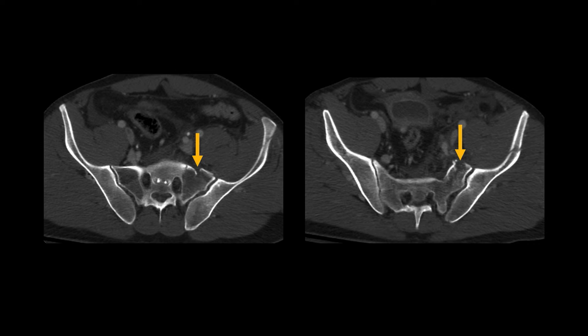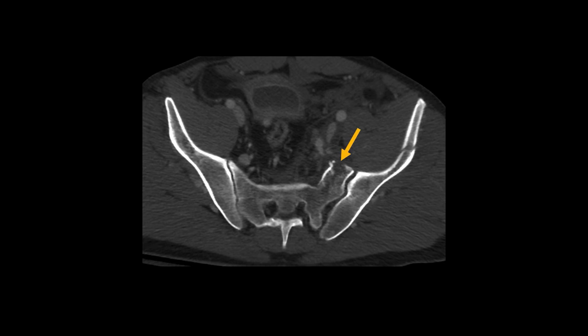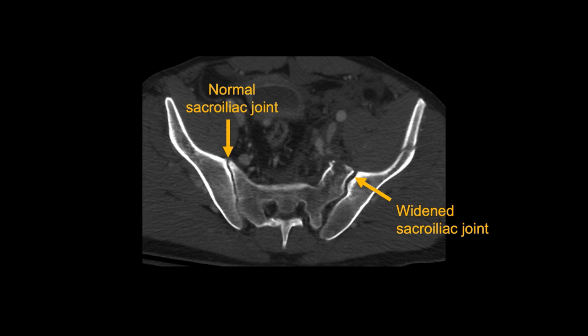These injuries can also be associated with widening of the sacroiliac joint. In this patient, there is injury to the left sacrum, with cortical irregularities and linear defects extending deeper into the trabecular bone. The sacroiliac joint is slightly wider on the left than on the right, but it is a fairly subtle difference in this case.